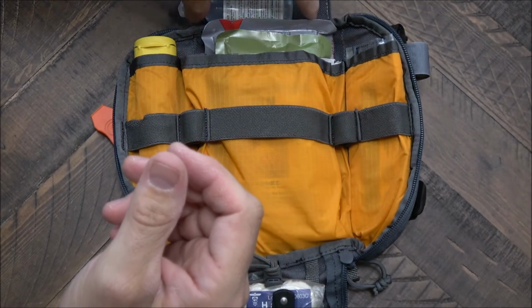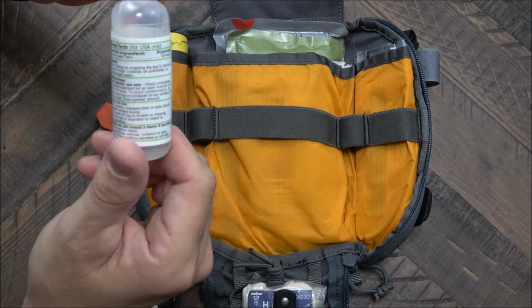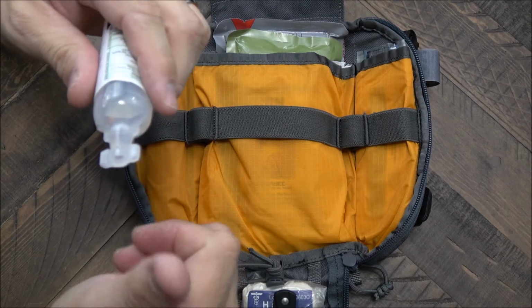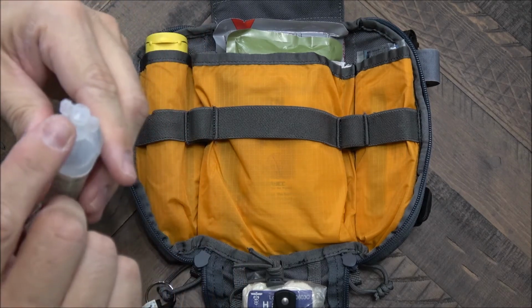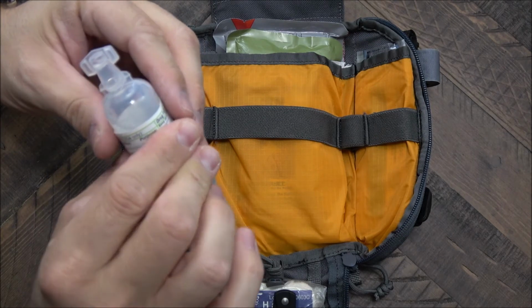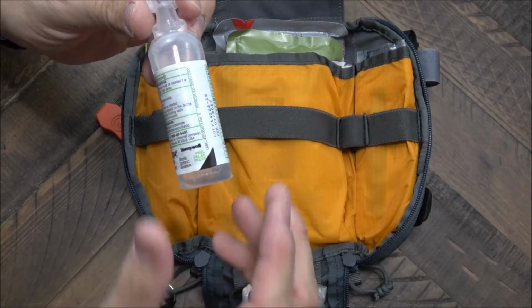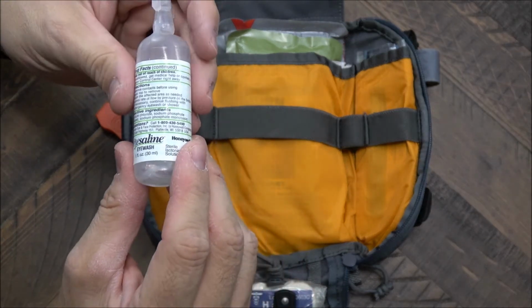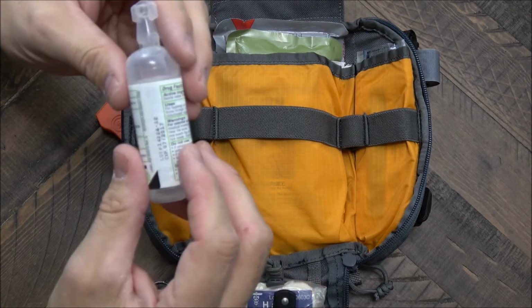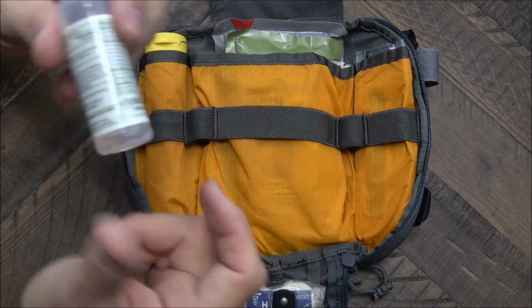So here on the top, I keep what is actually a kind of mobile eye wash station, if you will. You just basically break this tab off. It's got a much larger opening so that you can apply some pressure to this and get a little force behind it and wash out any kind of debris that you may have in your eye. It's essentially really Visine, if you will. But anyway, it's small enough and compact that I can keep it here in this kit, so I do.